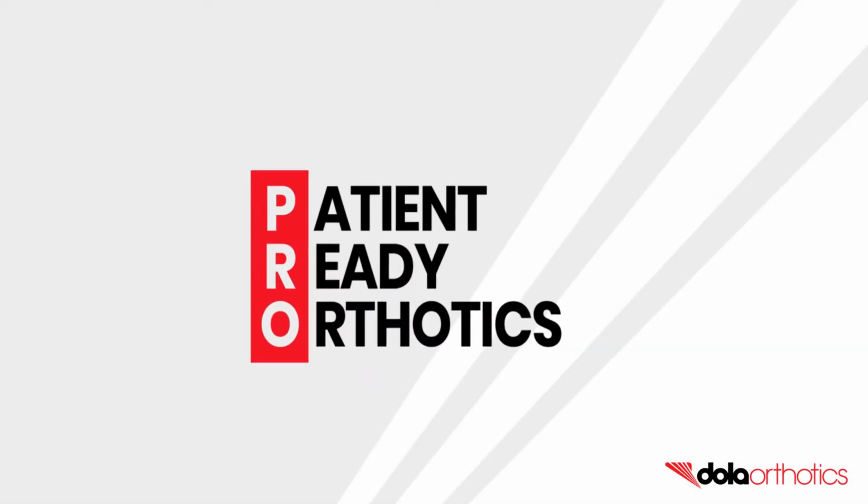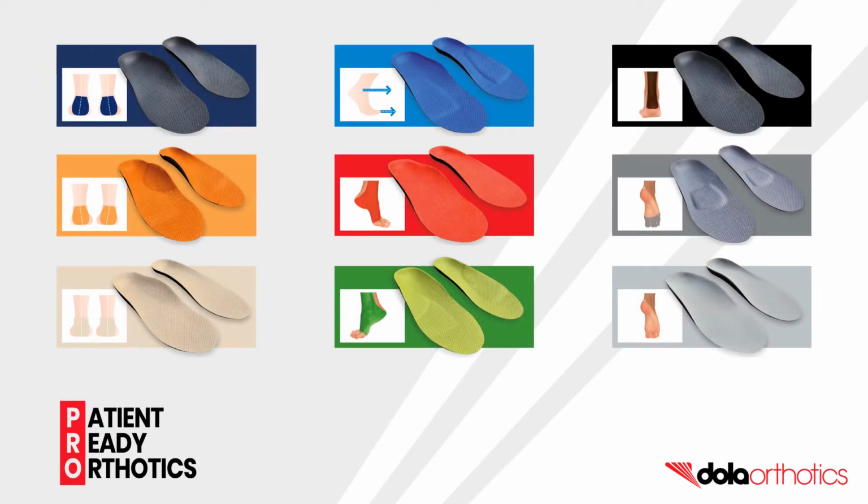DOLA patient-ready orthotics. The orthotics podiatrists use. A collection of our 9 most popular and proven prescriptions developed from over 50 years of clinical and orthotic experience. Patient-specific styles, ready to fit in clinic, orthotics for health professionals only.